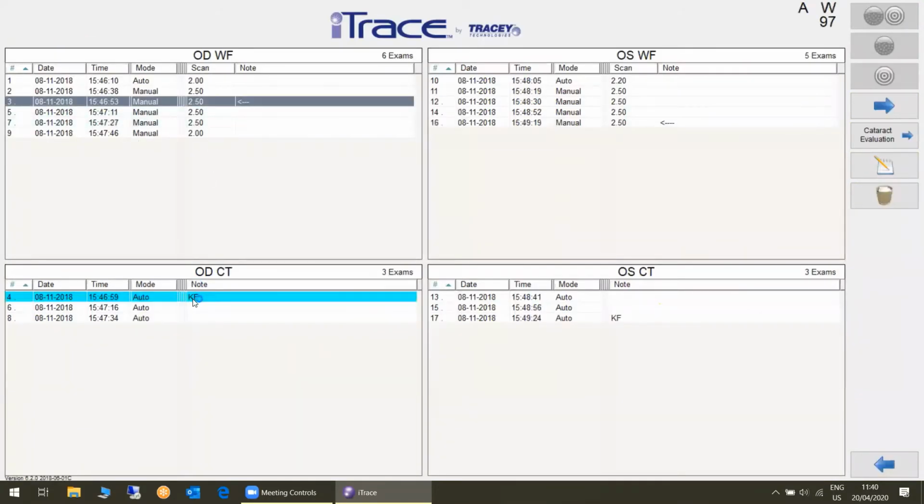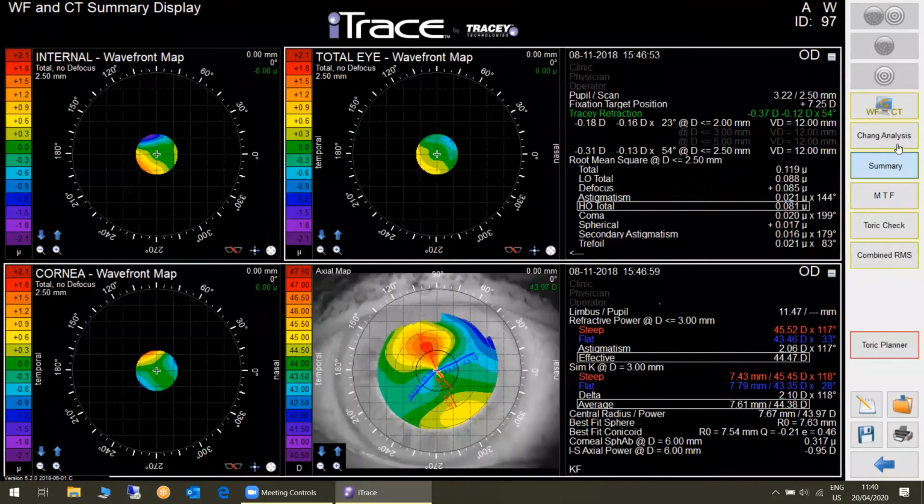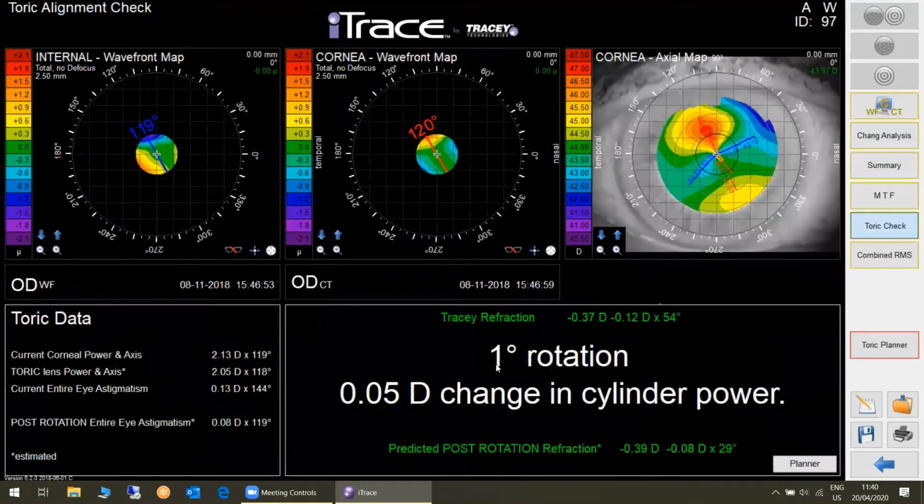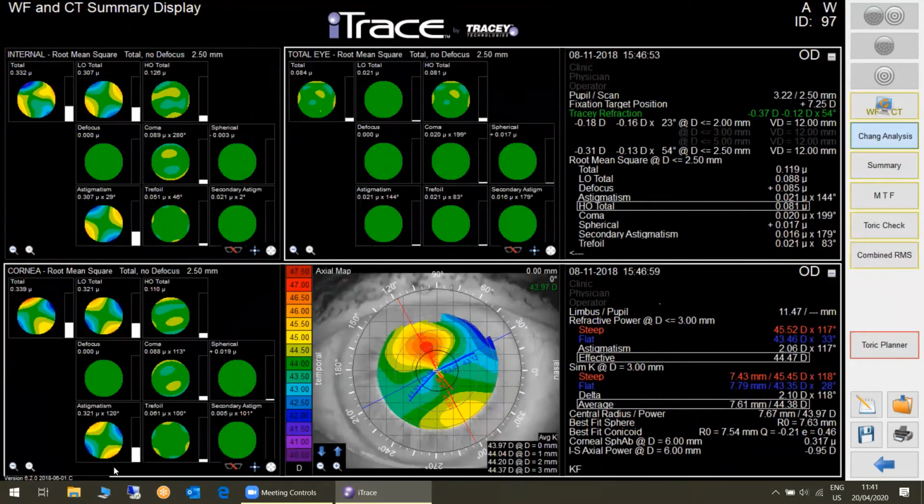This is a very brave surgeon, because she operated on her mentor. And the mentor got 2 toric lenses. And we see here, the first eye, the astigmatism is at 120. So the lens should be at 30, but it's at 29. 1 degree off, you know, in ophthalmology, 1 degree does not exist, okay? But the beauty of this is, look, this minus this is 0. It's perfect. This is a perfect case.